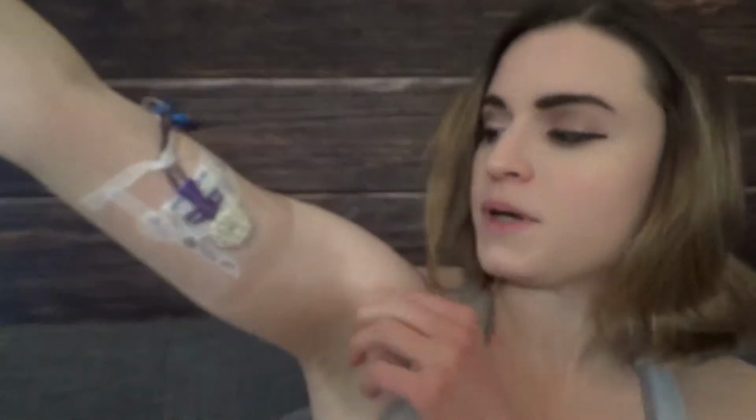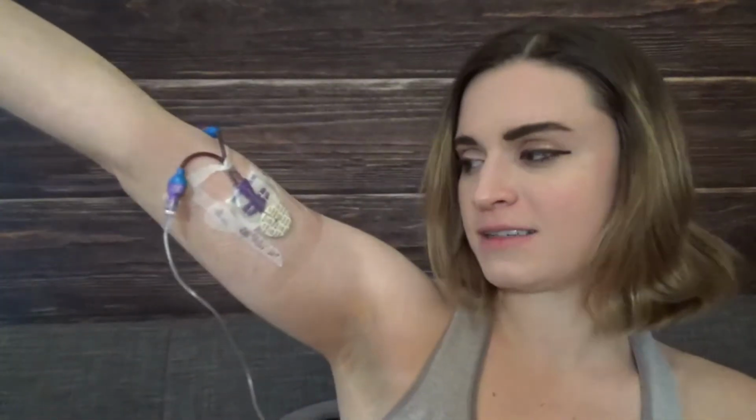Well, this is my PICC line. It is on my right arm, but yeah, this is what it looks like. I have a double lumen power port PICC line, and it is invaluable for getting infusions. Otherwise, they would have to obviously use veins, and my veins are notorious in my local hospital for being very difficult to get. So they always collapse, and there's always an issue, and it's usually due to my chronic dehydration. But yeah, I just wanted to give you guys an idea of what my PICC line looks like, and let me know if this is something that you also have for your disease.